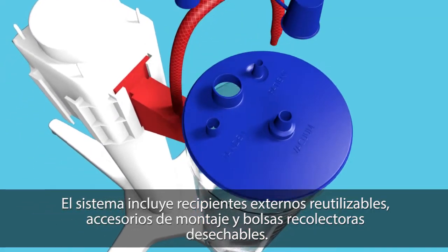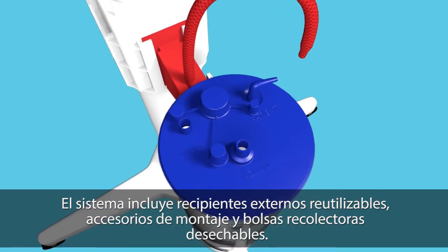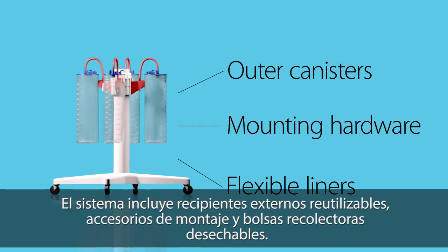The system includes reusable outer canisters, mounting hardware, and single-use flexible liners.